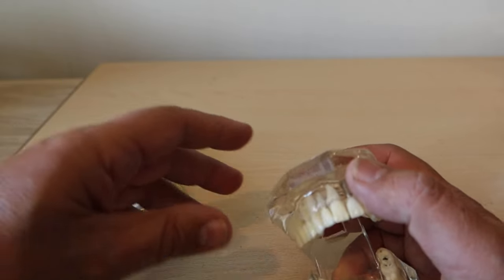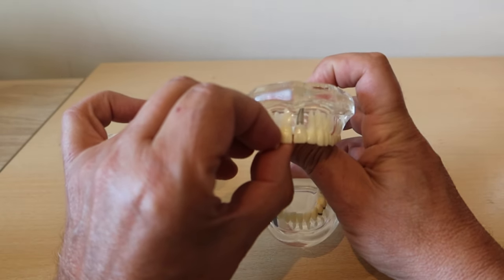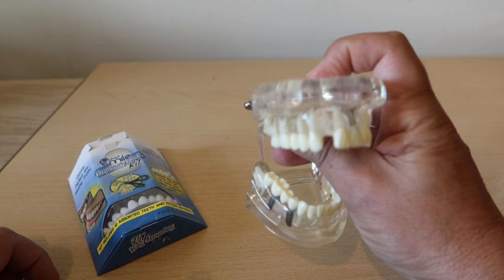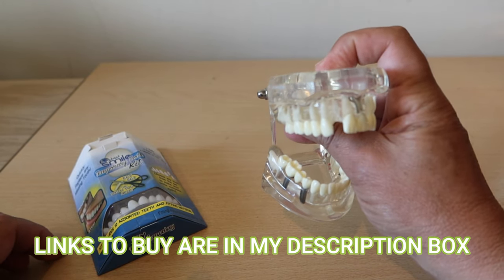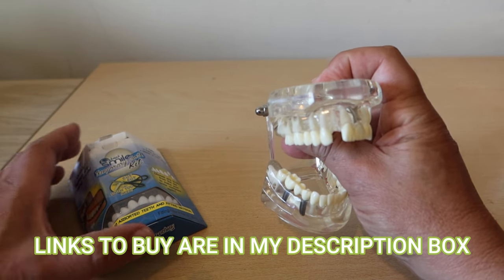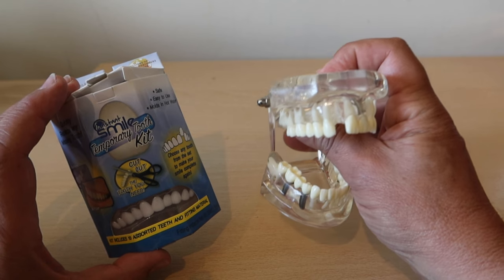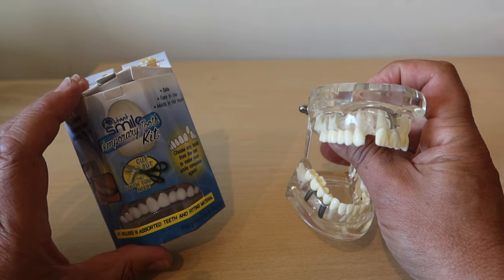Now my poor little friend here has lost a tooth. That's going to be very awkward if you can't get to a dentist and you're going to be going out or seeing people, because that's a big hit on your confidence. So what this little kit does is it gives you a temporary fix to that problem.